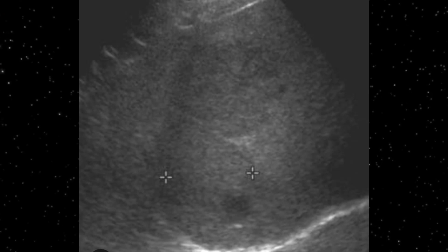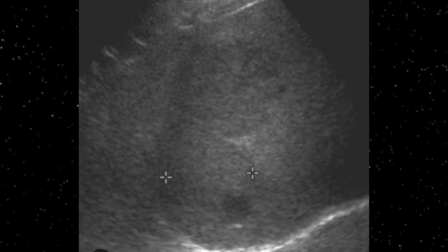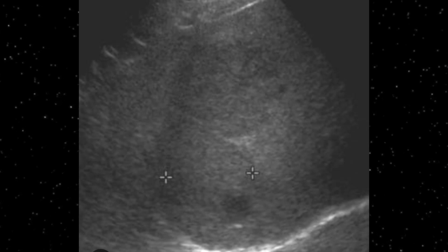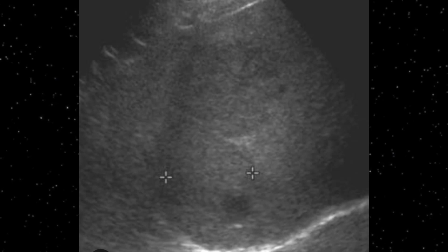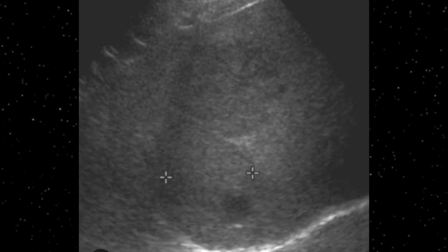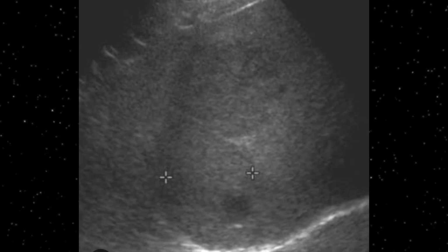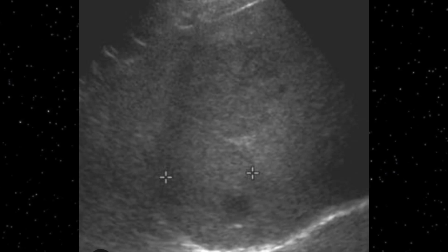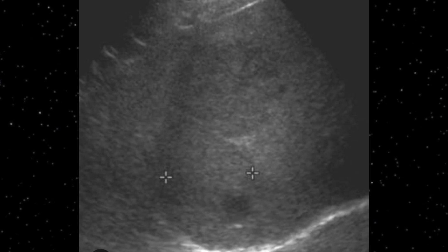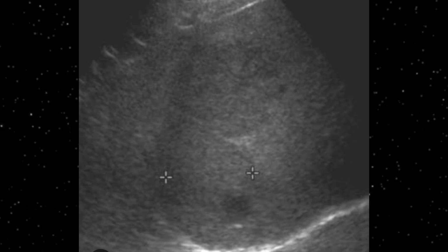Have a look. This is another transabdominal scan, and on it you can appreciate two well-defined hypoechoic, rather slightly isoechoic lesions sitting within the right lobe of the liver. These are two in number, round in shape, with a slightly isoechoic pattern. So if you do not concentrate, you may miss these lesions. However, central scar is not visible in this image. It's a homogeneously, slightly hypoechoic lesion with a round wall.